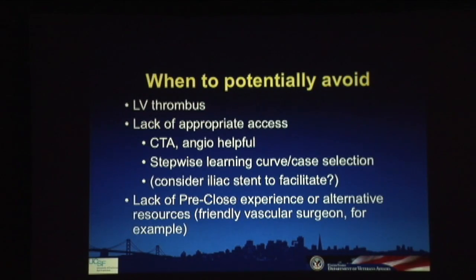So when do you want to potentially avoid it? LV thrombus is one of the things. Patients with bad EFs occasionally have LV thrombus on their echo, and that's probably a bad idea to put an Impella, certainly into the ventricle. And then lack of appropriate access.